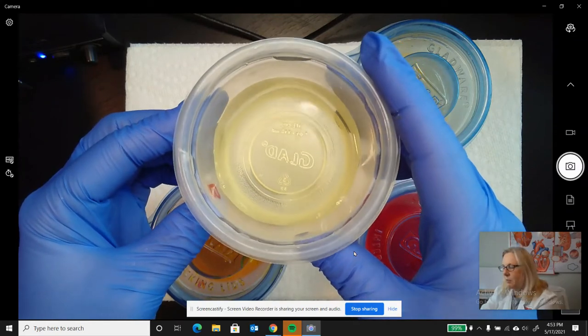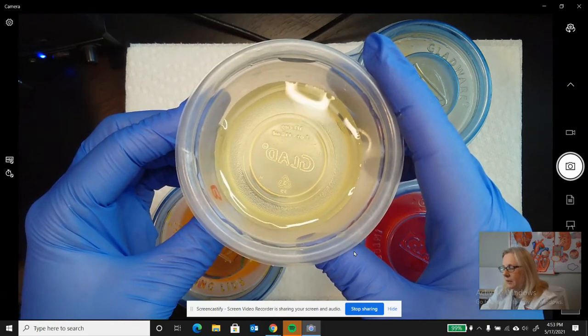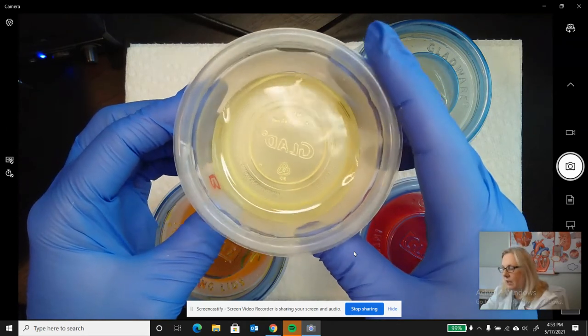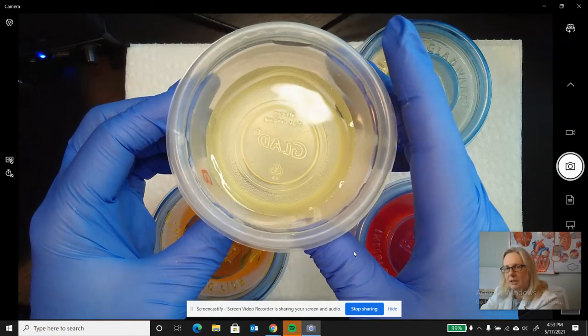And the clarity. Remember, clarity is, is it clear? Are there floaties in it? Is it turbid? Is it cloudy? Can I see through it? If you can see through it, you see light through it, and there's nothing floating, it would be considered clear. You can see the color of it.